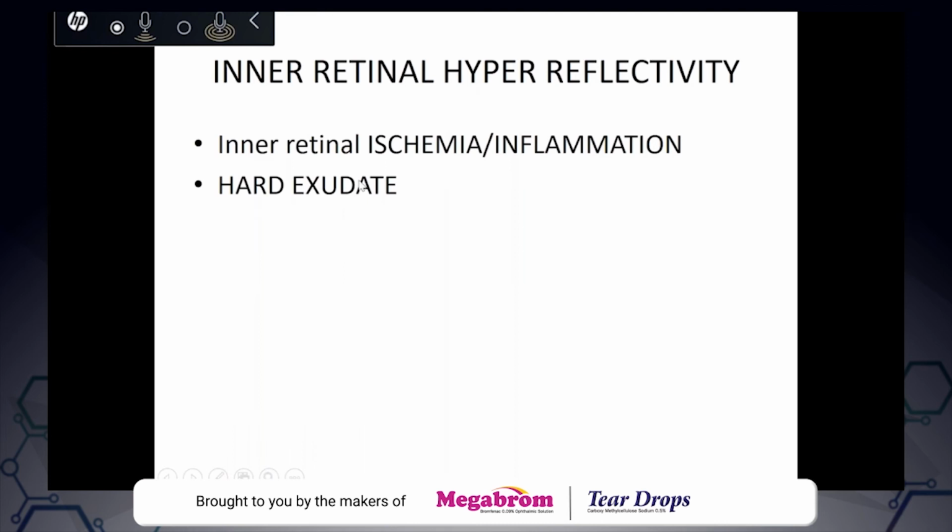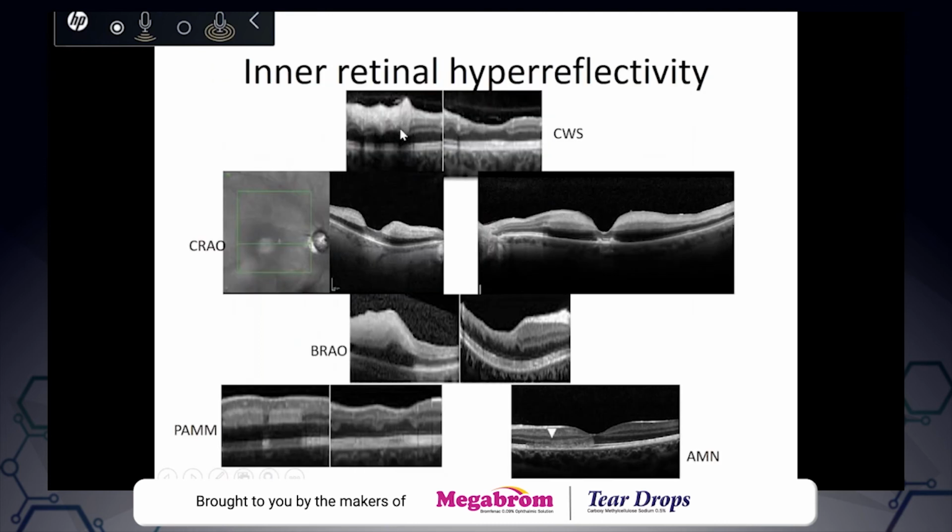Look at this patient. This patient has inner retina up to the outer plexiform layer that is hyperreflective here. Actually, these are large cotton wool spots. You know, by definition, cotton wool spots are large, extensive infarcts of the nerve fiber layer and adjoining retina. You can see here, this patient subsequently recovers. This regresses, and you can see this side of the retina is normal, but the area where the cotton wool spot has regressed, there is atrophy of the inner retina.